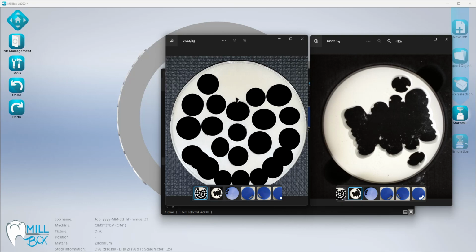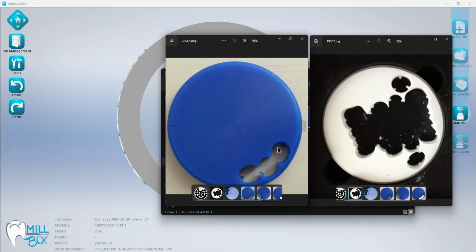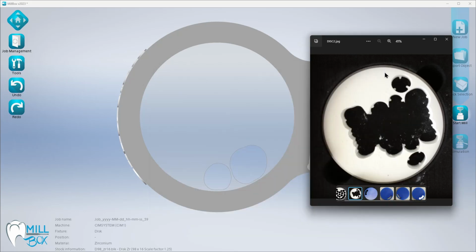So here you can see I have some disks. In some cases I can import these straight as an image. In some cases I have to make some modifications, maybe in Paint. You can see here I had some dark shadows which actually threw off the algorithm. So in this particular example, I just used Paint to go in and create a contrasting surface so that way the CAM software can detect the differences there and kind of map out a stock based off of that image.